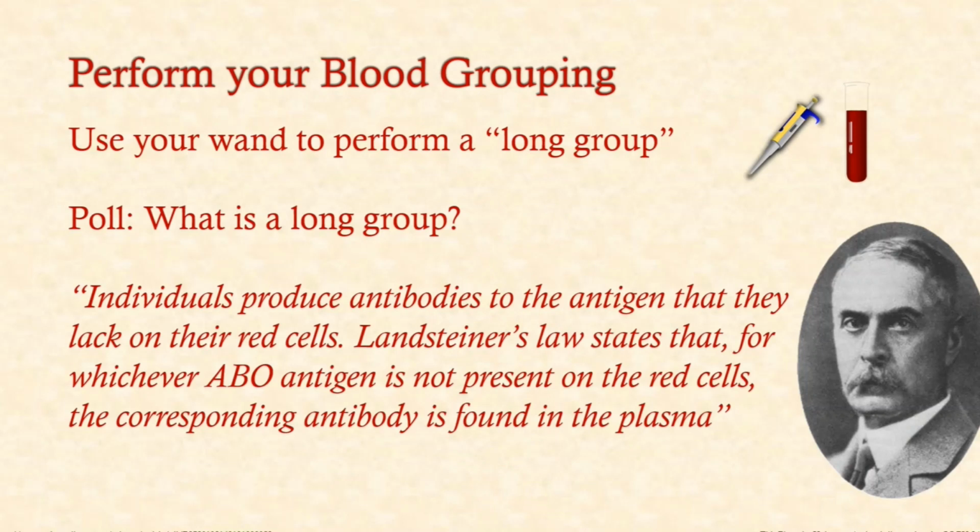So we're getting ready for our next poll question here. I'll just get your finger at the ready, Danny. So what is a long group? Because some of you might be sitting there thinking, what on earth is Helen talking about? So what is a long group? Is it a forward group only? So that's when it's just the patient's red cells. Is it a forward and reverse group? So that's the patient's red cells and the patient's plasma. Is it a reverse group only where you're testing just the patient's plasma? Or is it a group that takes a very long time?